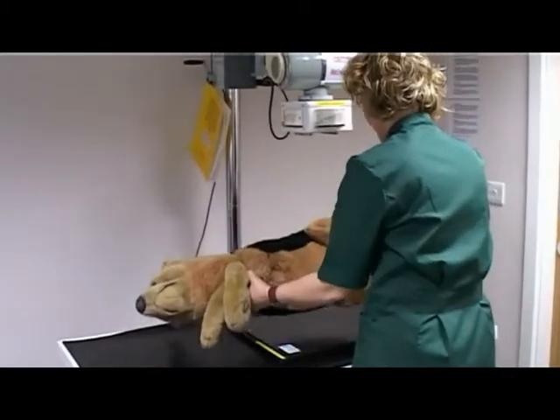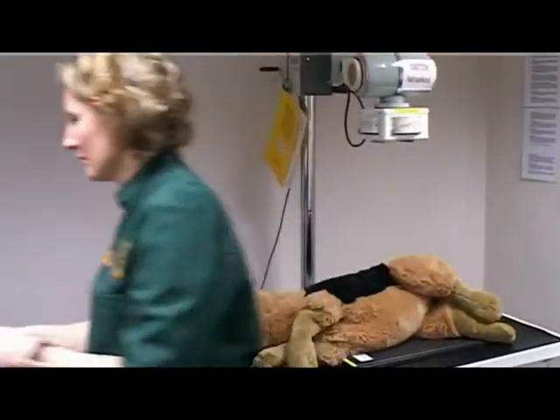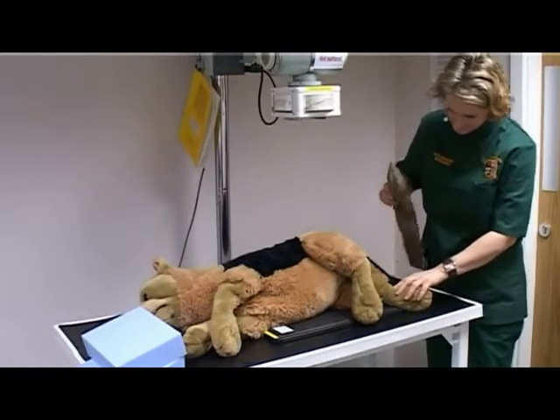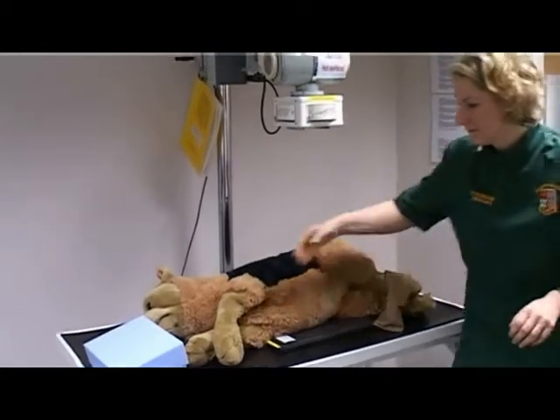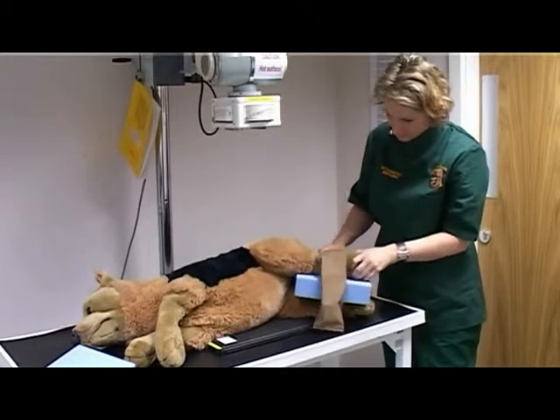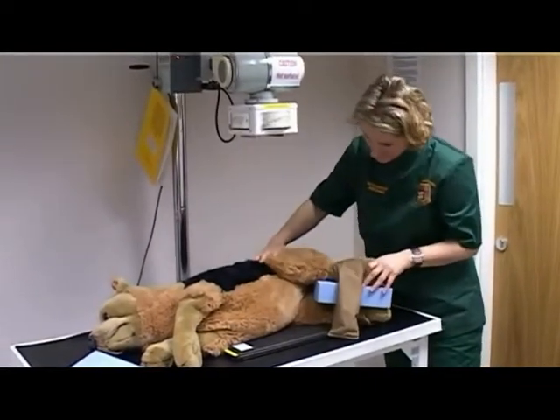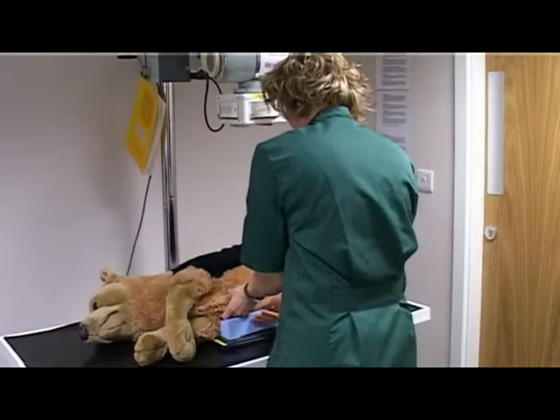Place the patient in lateral recumbency with the caudal abdomen positioned on the cassette. Select the positioning equipment. Extend the hind limbs caudally and secure each limb with a sandbag or tie. Place a small foam wedge between the stifles and another under the sternum to ensure that the median plane of the body is parallel to the cassette.